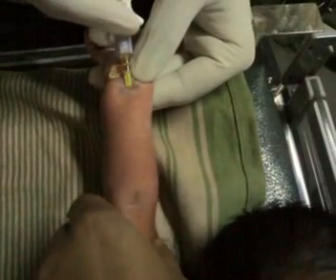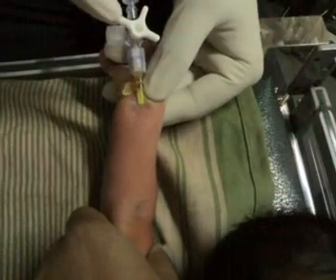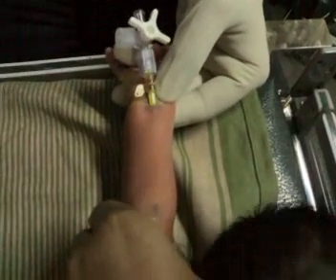Now block this, remove the syringe, and plaster the artery.